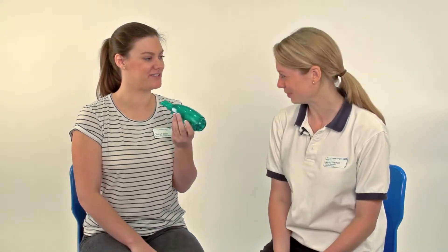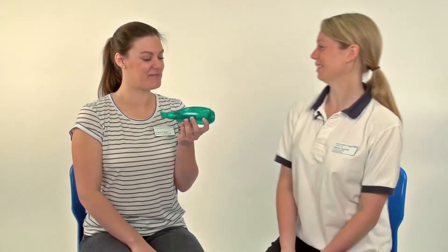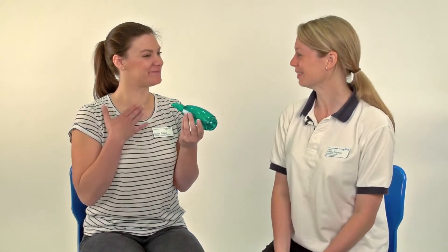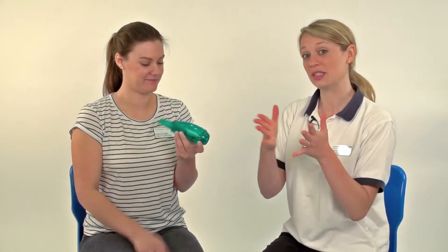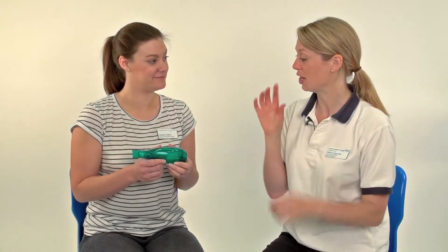How does that feel? It feels very strange. Strange in what way? Just the wobble — it feels like I can feel it right here. That's good. The wobble obviously helps you move any of the secretions along the airways. You've got a really good technique — you're keeping a good seal in your mouth and you're blowing out nice and long, and you can hear that it makes a bit of a funny noise. For some younger children they quite like this choice of airway clearance device because it makes a funny noise and it's a bit more fun, but it's very dependent on the patient and how they are clinically as to which choice we use.